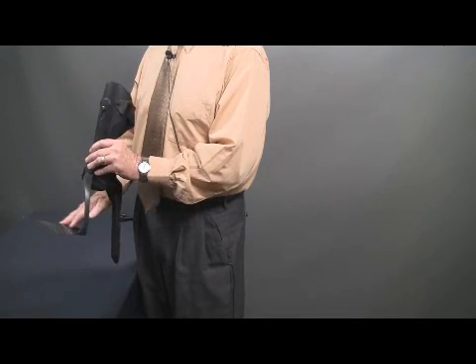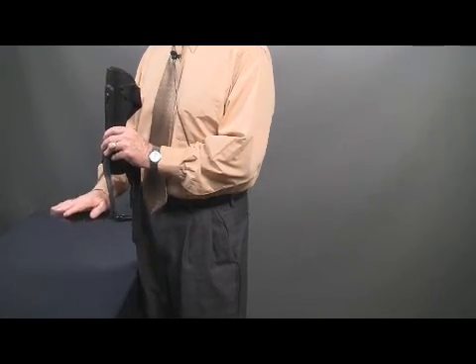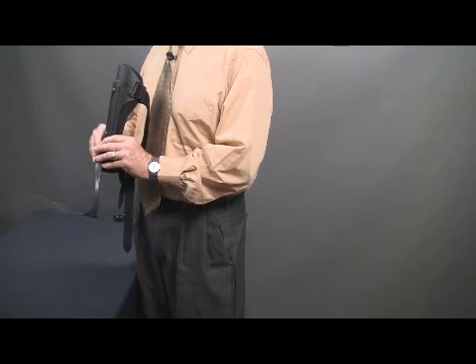It is not a full foot plate length. It's not full. It goes to the sulcus. It's sulcus length foot plates on all three. It is measured in centimeters with a foot length measurement.